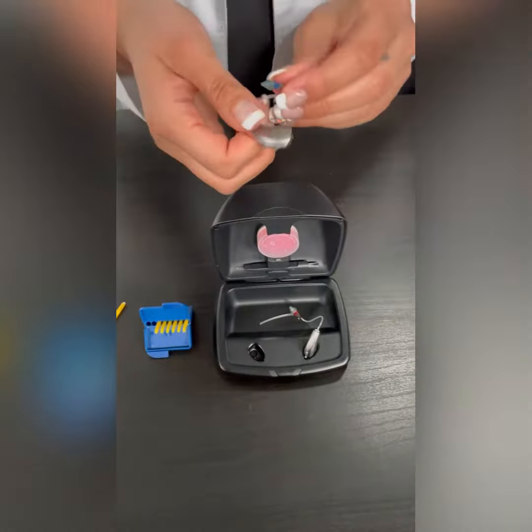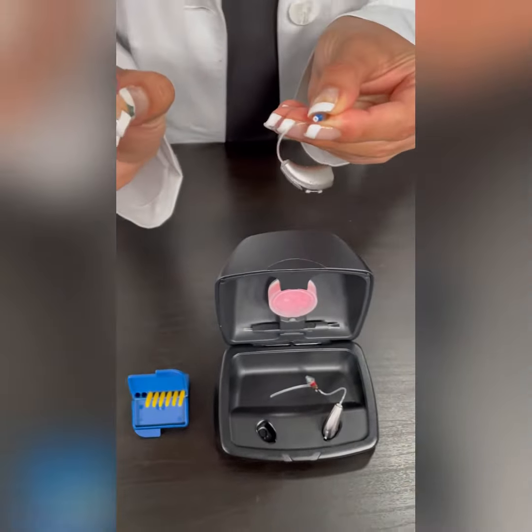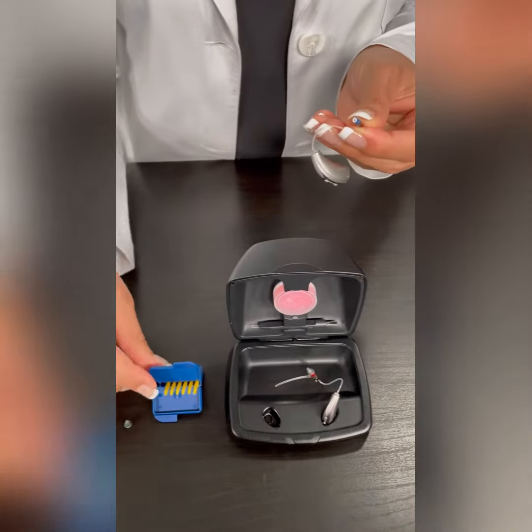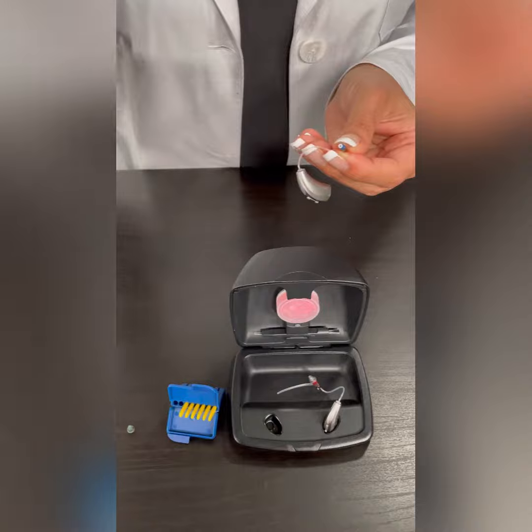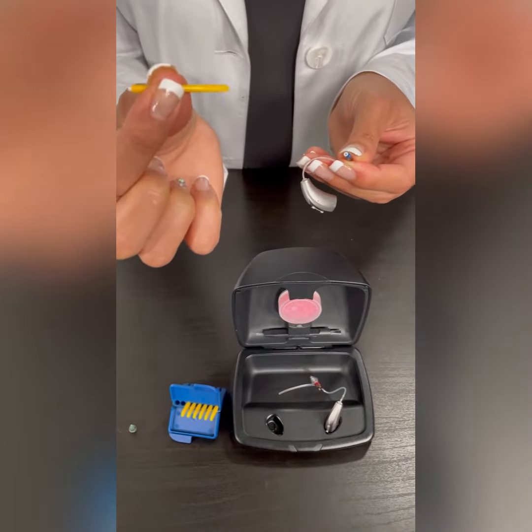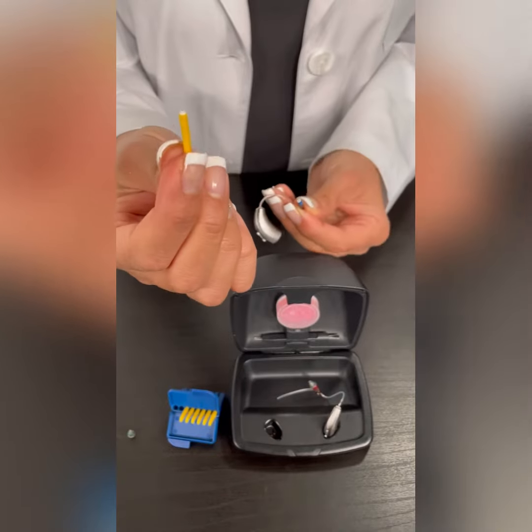We'll start by removing the plastic dome. You'll pull it right off. You have your filters in the case. What you'll want to do is take one of the sticks out. You have an empty end of the stick as well as a white end.